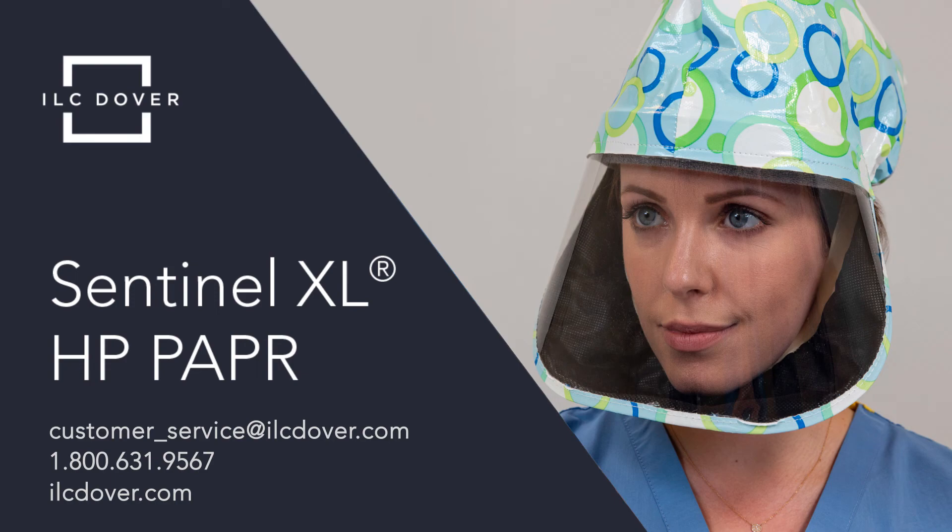The Sentinel XL HP PAPR system from ILC Dover — state-of-the-art protection for the most demanding applications. For more information, contact us today.